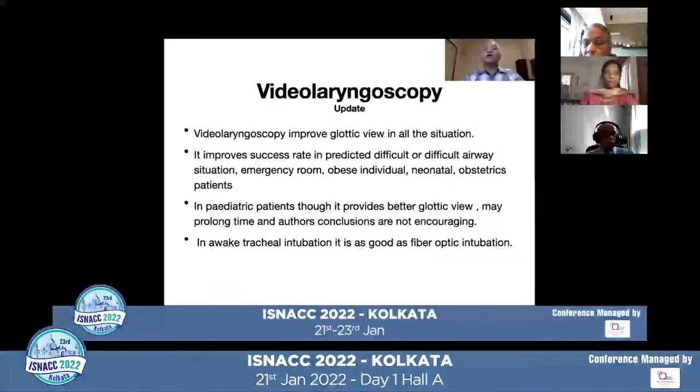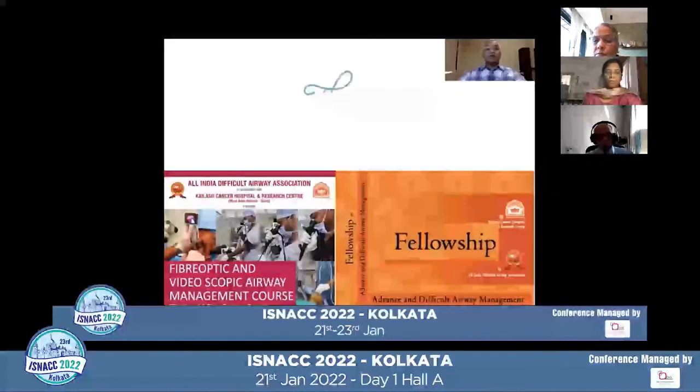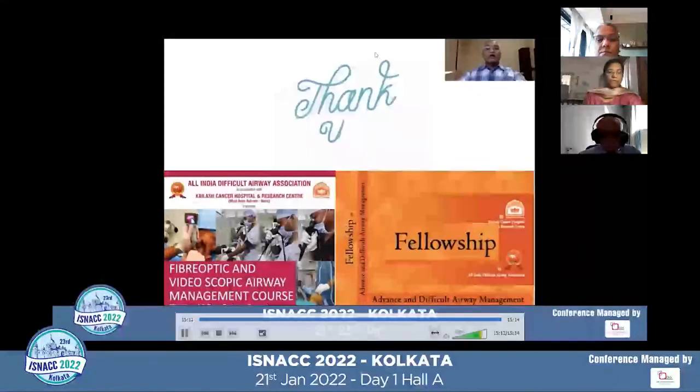So at the end of my lecture, video laryngoscopy definitely improves glottic view in all situations. It improves success rate in predicted difficult or difficult airway situations. It has been found helpful in the emergency room, obese individuals, obstetric patients, and neonatal patients. In pediatric patients, though it provides a better glottic view, it may take prolonged time and the authors' conclusions are not encouraging. And in awake tracheal intubation, it is as good as fiber optic intubation. Thank you for your kind attention.